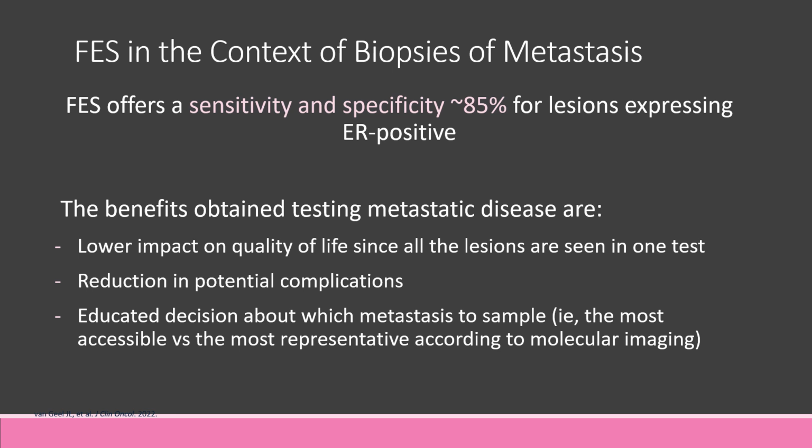So from all the research that has been done with FES studies, the overall sensitivity and specificity of FES is about 85% for lesions that express estrogen receptors. Specifically in terms of metastatic testing, information about ER expression will have a lower impact on the quality of life because all lesions are seen on one test, a reduction in complications, and helps clinicians to make an educated decision on which metastases to sample.